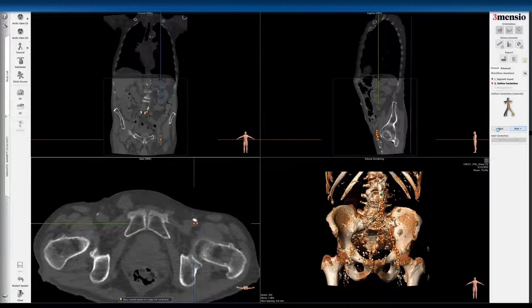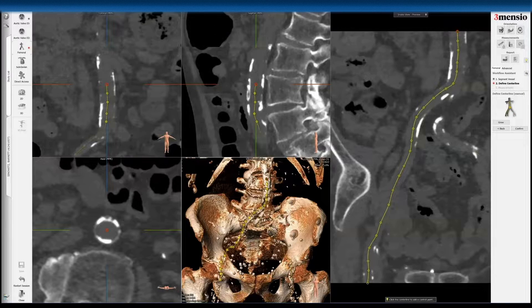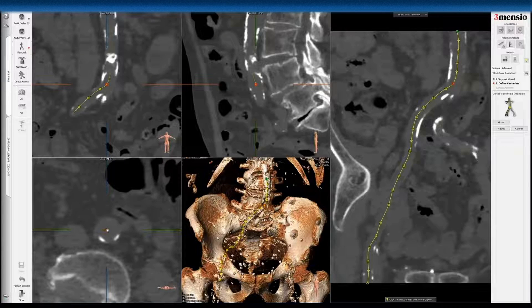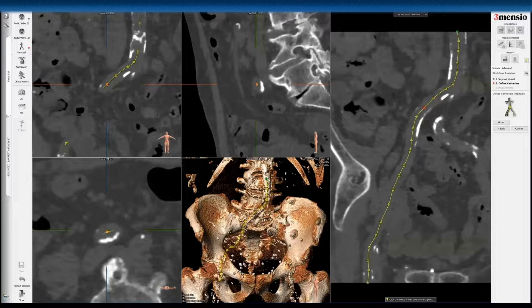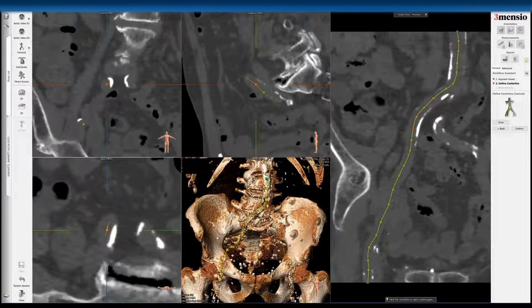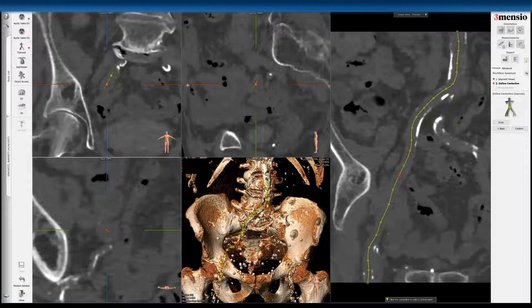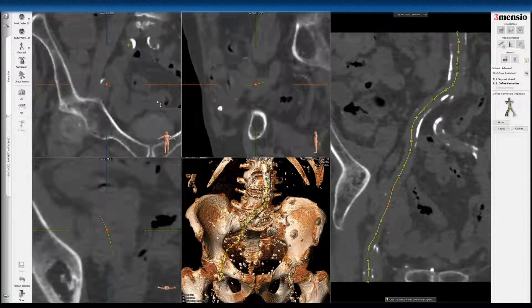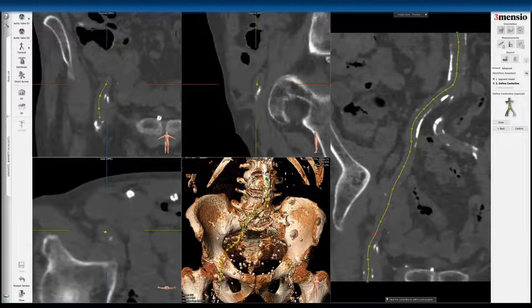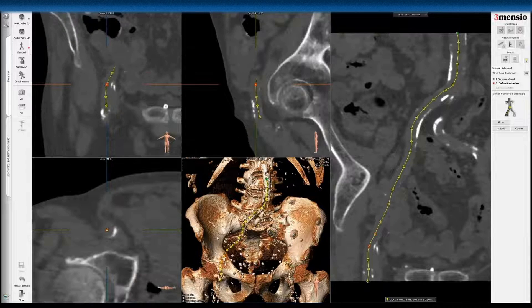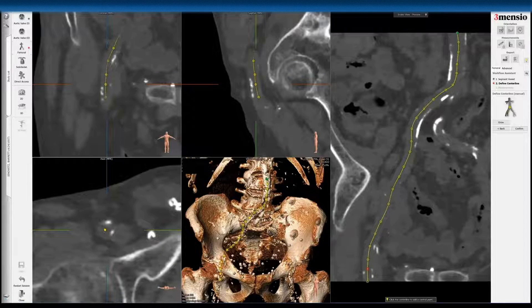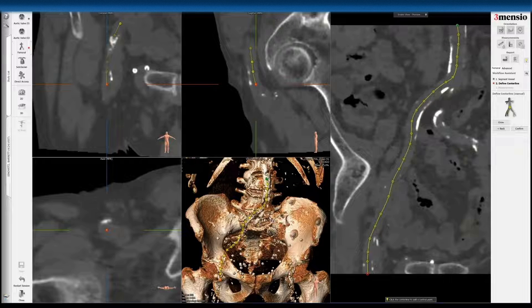So once you're done, you go to 'Next.' Now you can see that, similar to what you do with the CT angiogram, you now have to do the same thing in terms of confirming all these dots in the centerline. You can see there are a lot more dots than a contrast CTA because after all you are doing a non-contrast study. So you want to make sure that these are all in the centerline — it may be a little bit challenging to appreciate. If your line is very squiggly, you're probably not getting the centerline measurement correctly. So that's the right side, you can see.